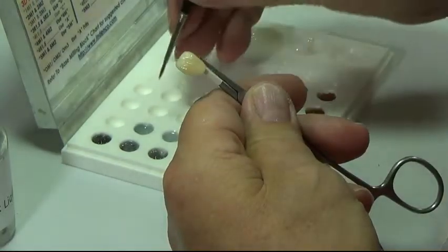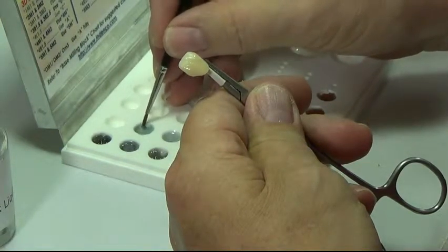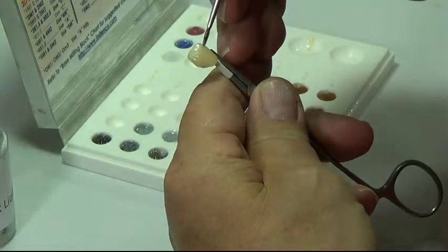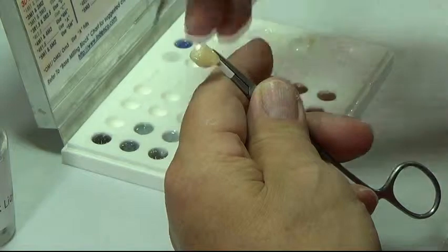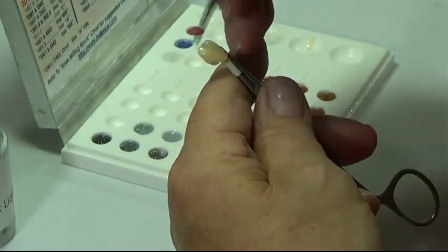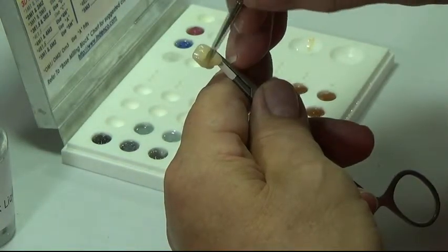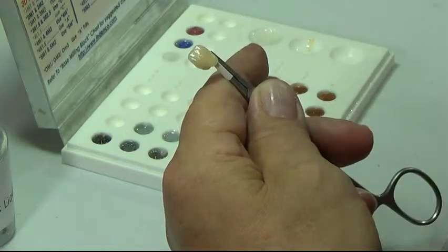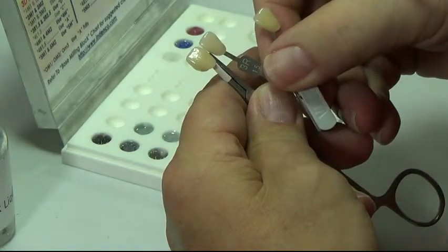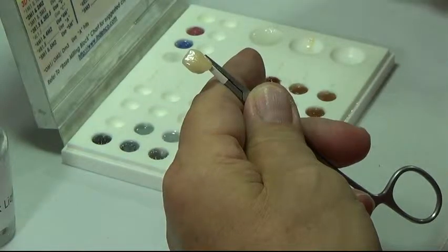Now to place the incisal — again, we only use the tip of the brush to pick up the color. With a smooth stroke, brush from the body up to the incisal, and then down the mesial and distal. Confirm our shade match, and now we're ready to put it on a peg and glaze it.